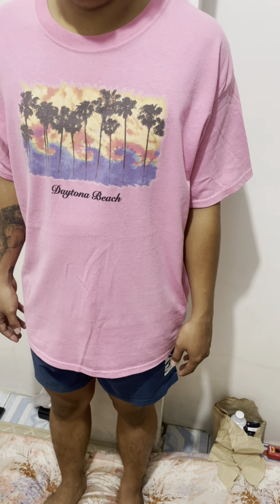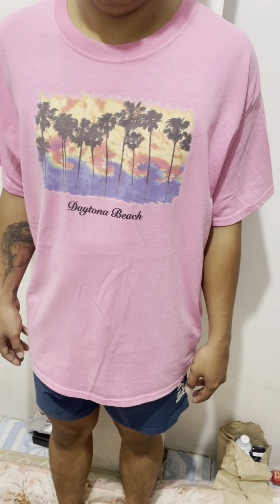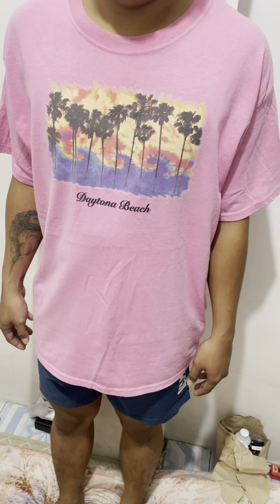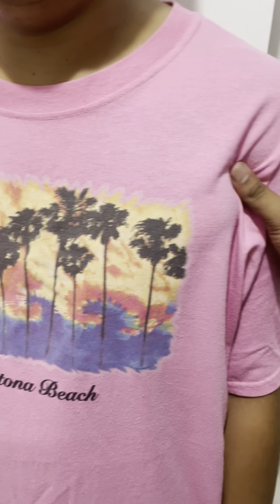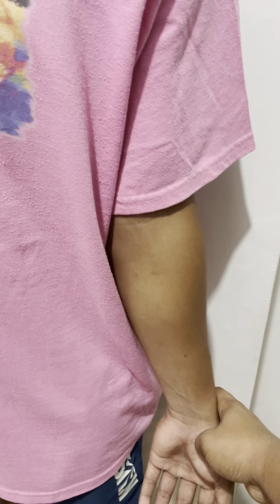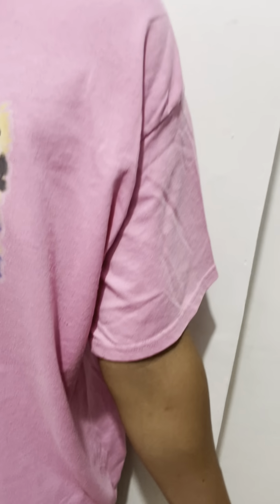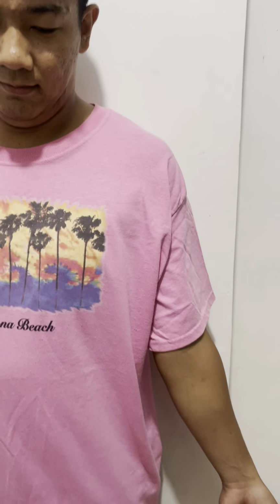Makikita po dito ang greater tubercle ng humerus at site of insertion of supraspinatus tendon. Pagilid po siya. And then susupinate po ang ganyan. Medyo ipapa-abduct natin. Ayan po.